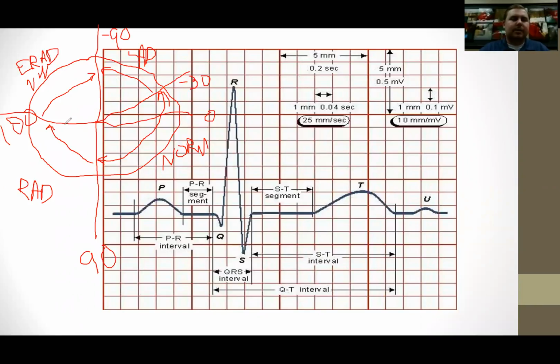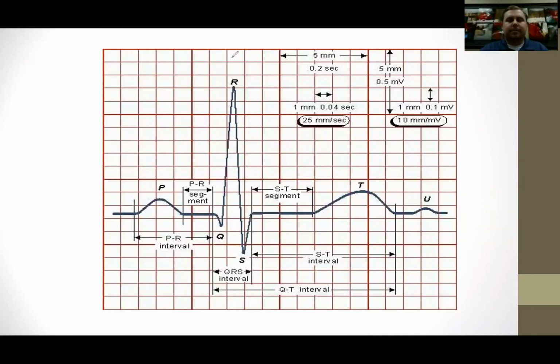You can find this little circle online that breaks up each quadrant by its criteria. And we'll get some more practice with that when we get to the examples at the end of this PowerPoint.